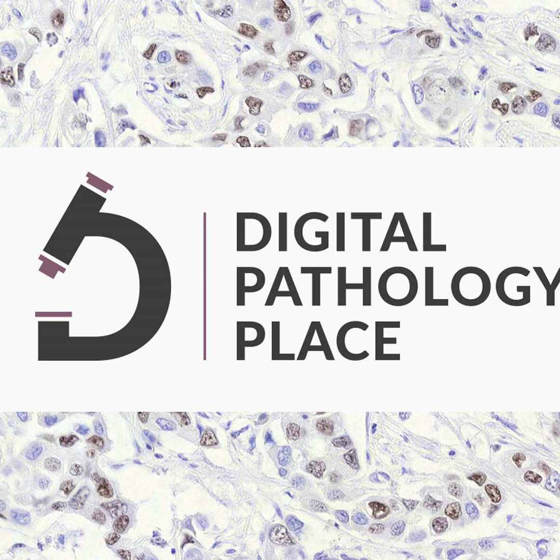So they proposed the model segmented epithelial cells well, but further work is needed for this subclassification into benign, in situ and invasive cells. Am I surprised? Not really. I'm not surprised by that, because if it's challenging, it's challenging for the AI as well.